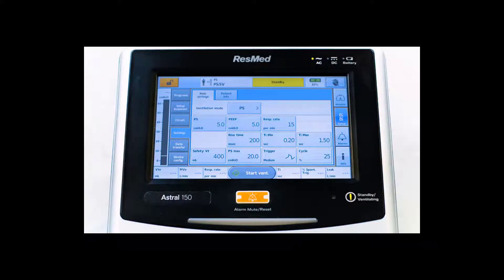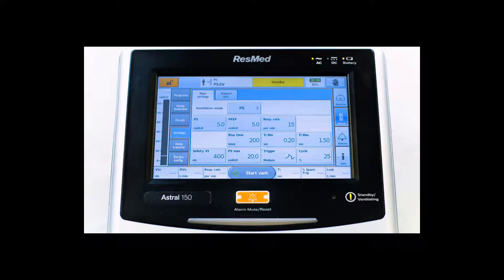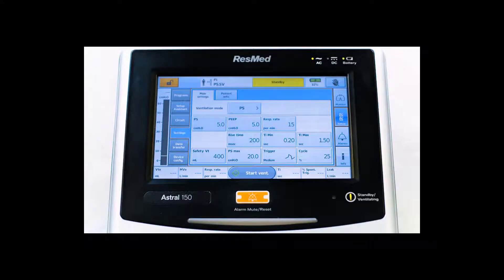You will also find your comfort features such as Rise Time, TI Min, TI Max, Trigger, and Cycle. We will leave those as default for the patient's initial therapy unless they express discomfort at the current settings.